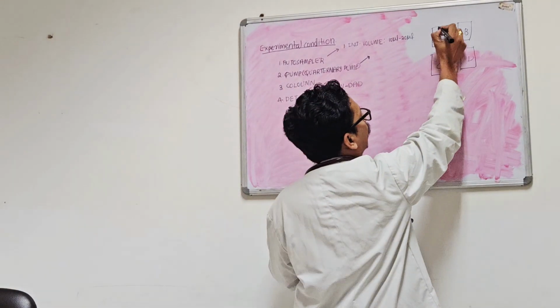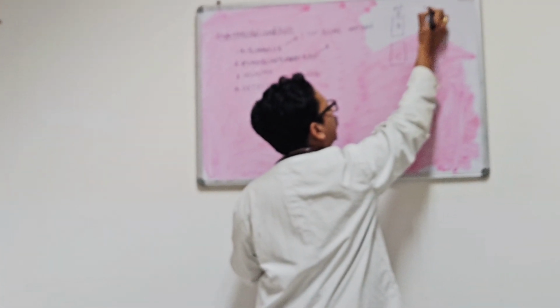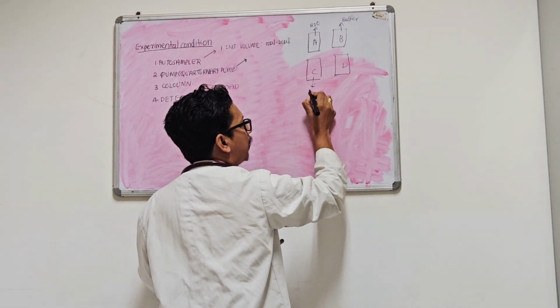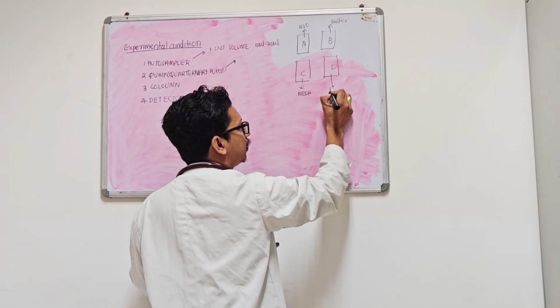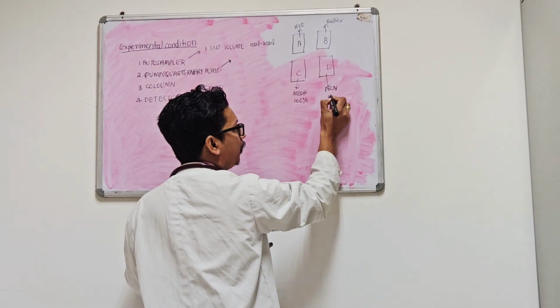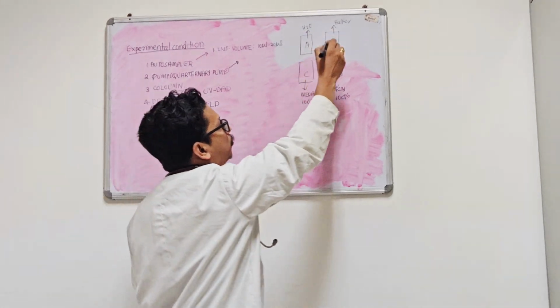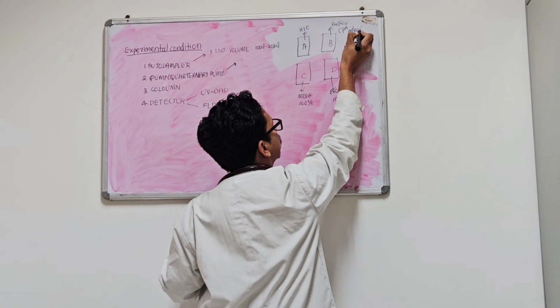We always use A filled with water, B always filled with buffer, C filled with methanol, and D filled with acetonitrile. Each will be 100%, but the buffer is always pH adjusted.